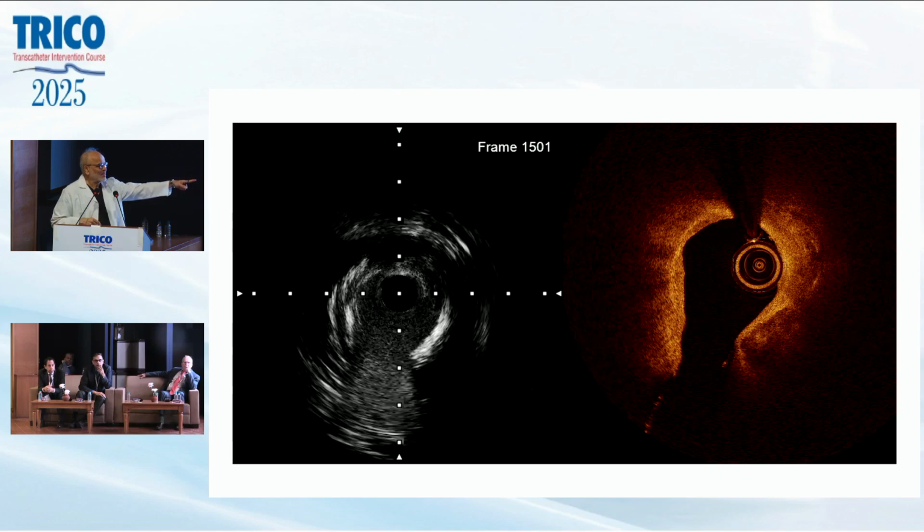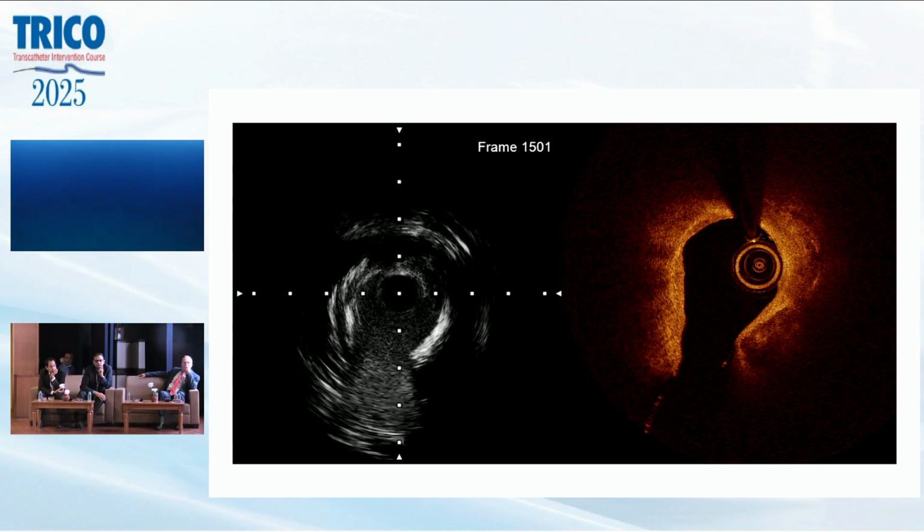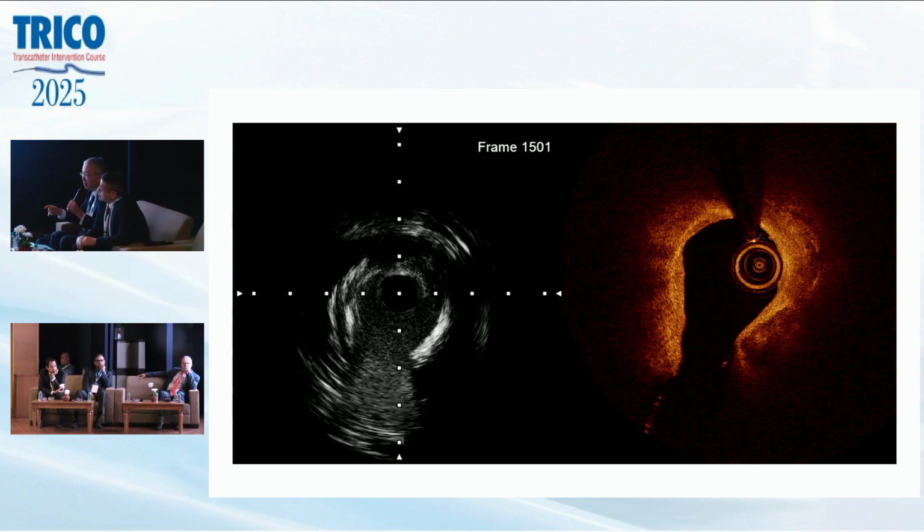Yeah. I think bifurcation with calcification sometimes brings a very big problem, because recrossing the wire is much more difficult if plaque shift occurred, because the plaque consists of so much calcium. So if a plaque shift occurred, it's very difficult.